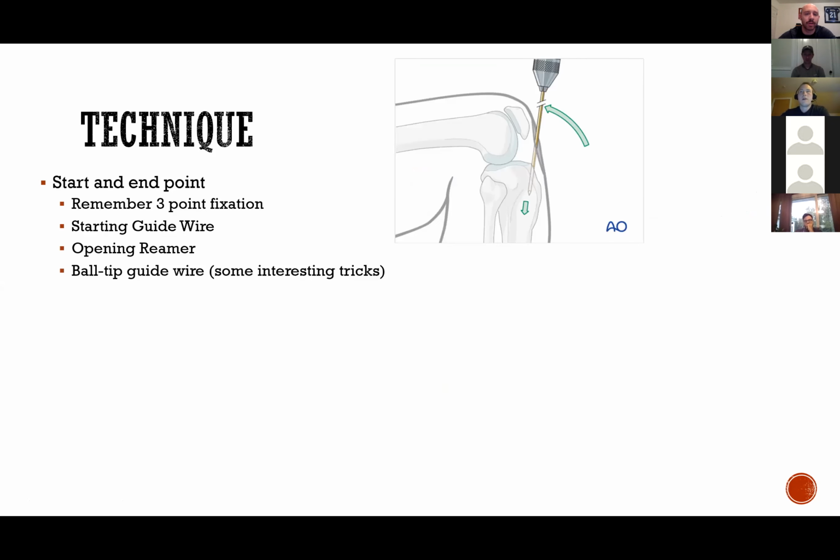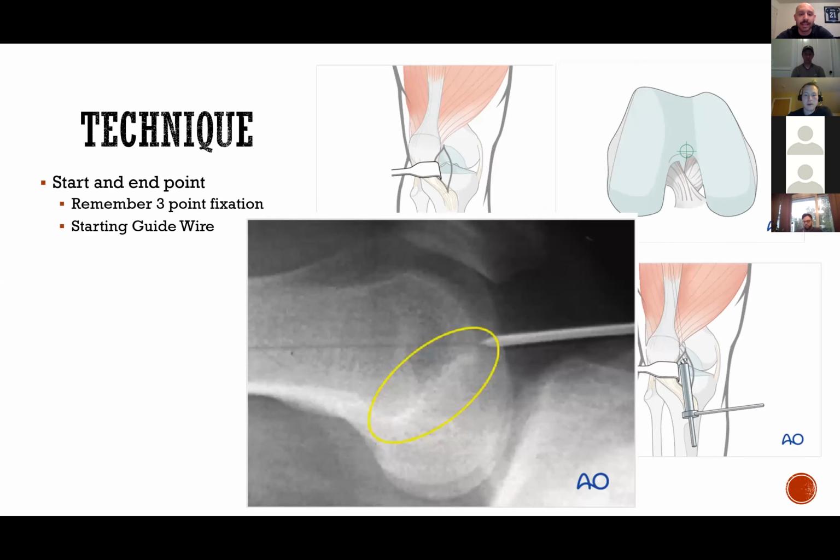Can I add something real quick? Yep. So the starting point also depends very highly on getting correct radiographs. You have to get a perfect AP and a perfect lateral of the area that you're getting, or your starting point is going to be off. Joe, do you mind just describing a perfect lateral of the knee, and how that would throw us off? Yeah, sure. So I have some good pictures of that a little bit later.